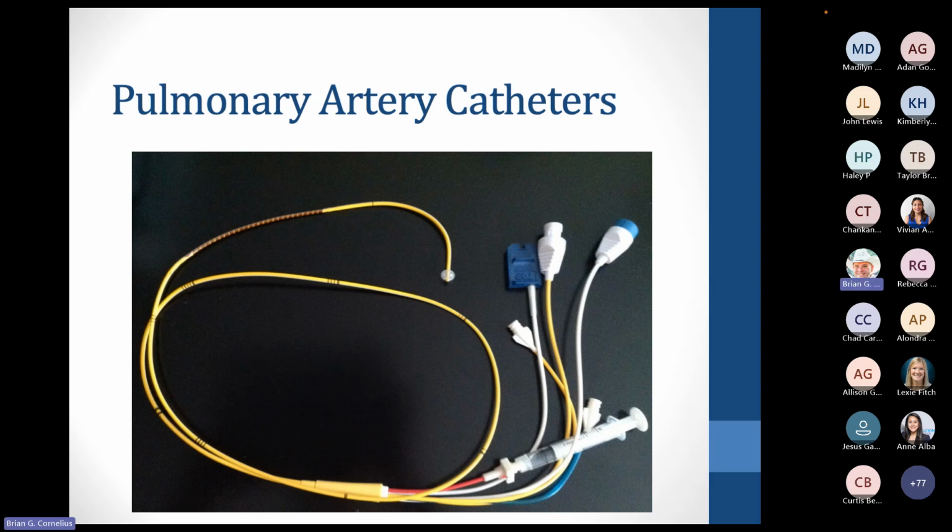Over time, we figured out that TEE may be a more effective means of monitoring the heart. So we don't use PA catheters quite as often as we did. But I think you'll still see that they're pretty common for open cardiac procedures. Not every case, but for the most part, they're pretty common.